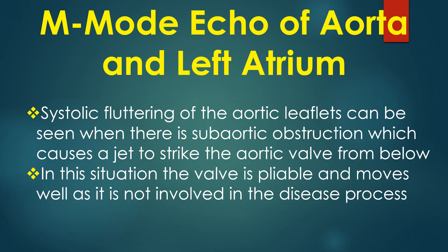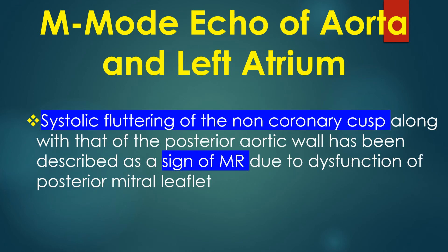Systolic fluttering of the aortic leaflets can be seen when there is sub-aortic obstruction, which causes a jet to strike the aortic valve from below. In this situation, the valve is pliable and moves well, as it is not involved in the disease process.